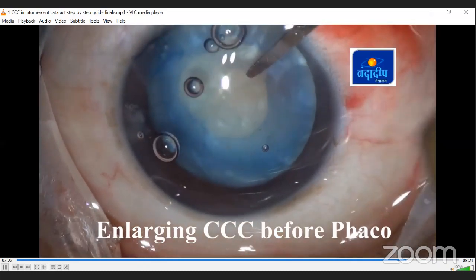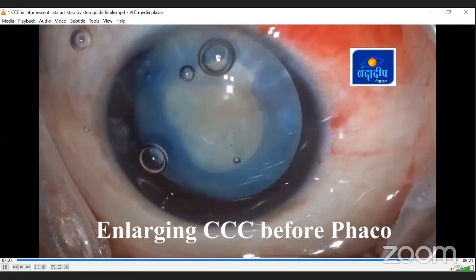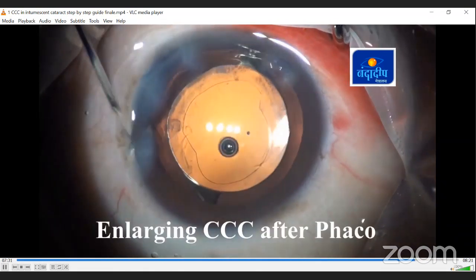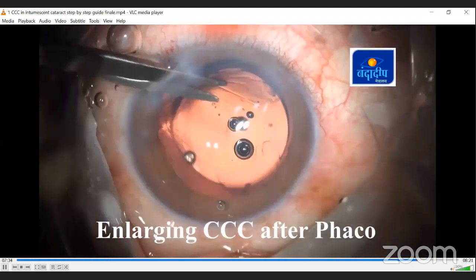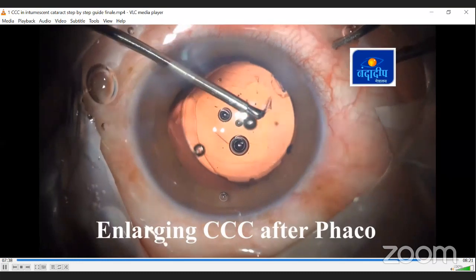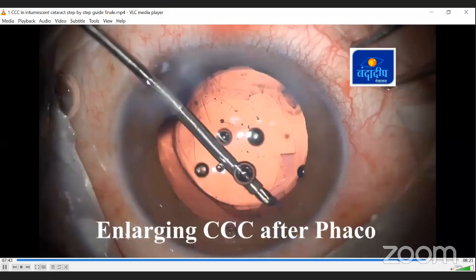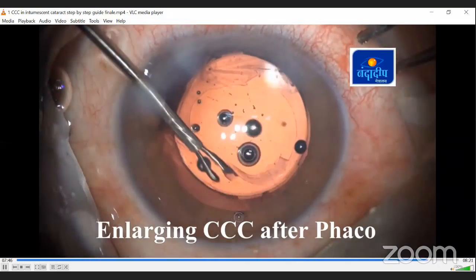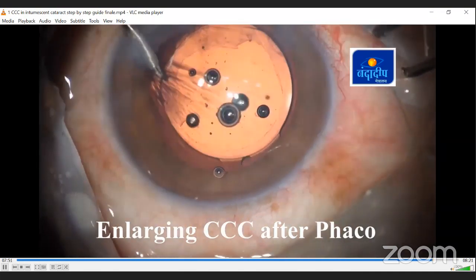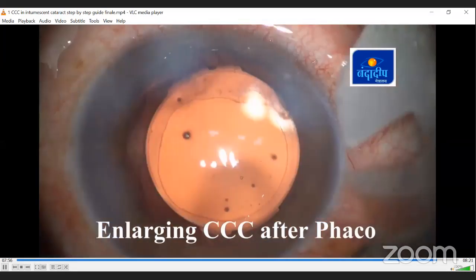Now you can do a small rhexis like you said in double rhexis. You can make first a small rhexis and then you can make tangential cuts with Vannas, and then you can enlarge the CCC later by using forceps. This can be done either after removal of the cataract or you can do it before also. After you have removed all the intumescence, you can do it. And also after putting the IOL, you can refashion the CCC as you want because there is no intumescence now. So you can easily manage the CCC.